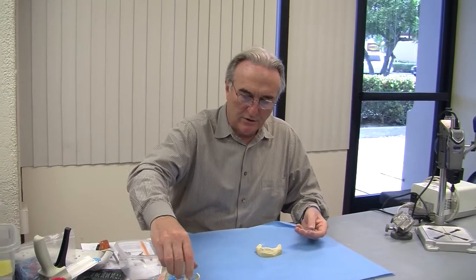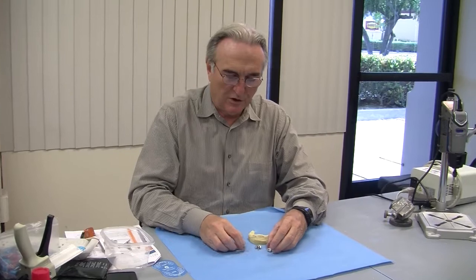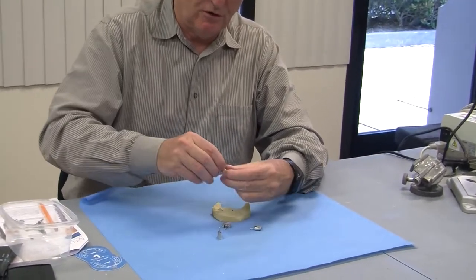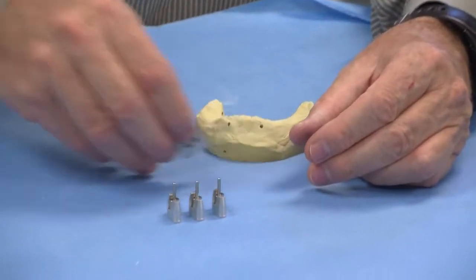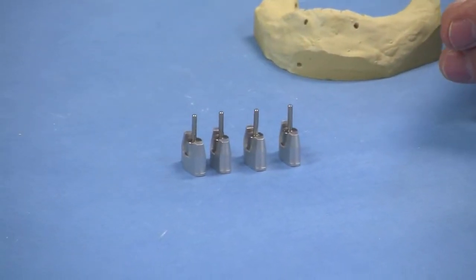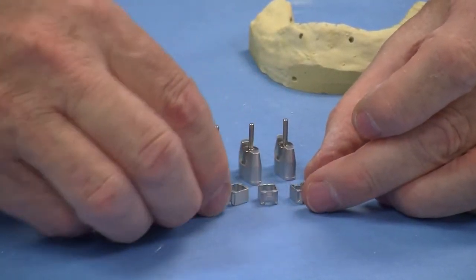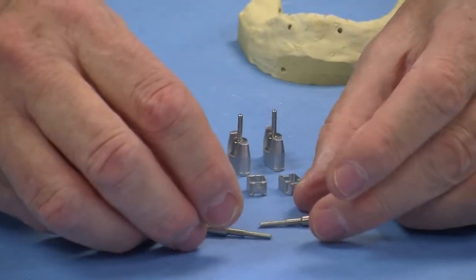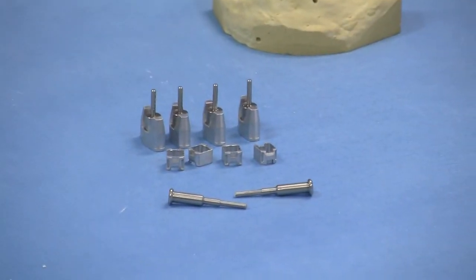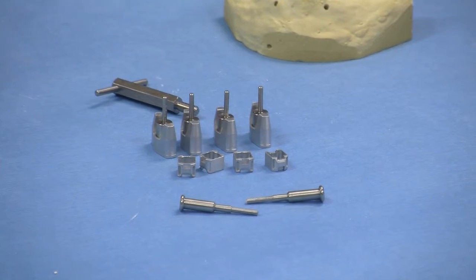Our model is now ready to assemble the guide. We need different parts for that. We need 4 guide holder pins of a medium size, and then 4 guide holders of a medium size, 2 pins for orthopedic screw fixation, and 1 handle to remove the guide holder pin.